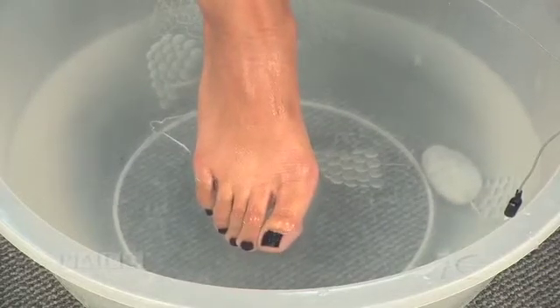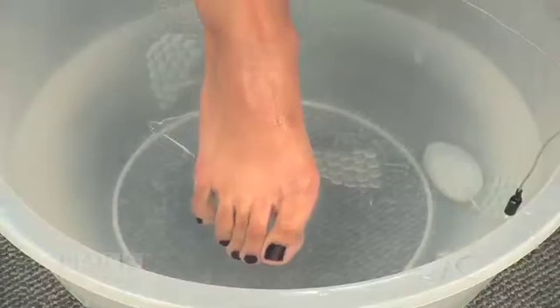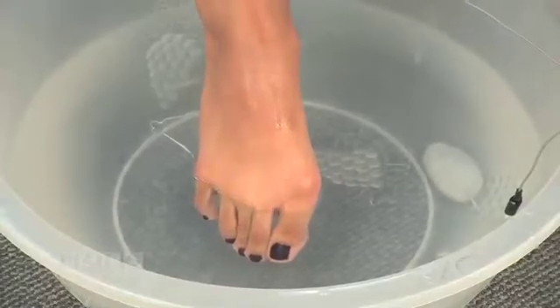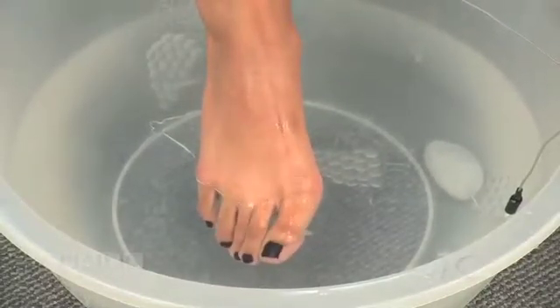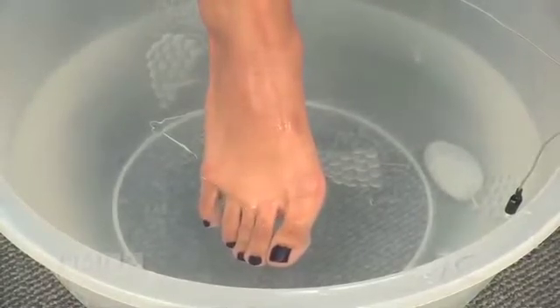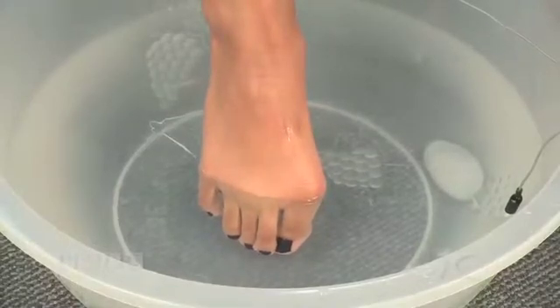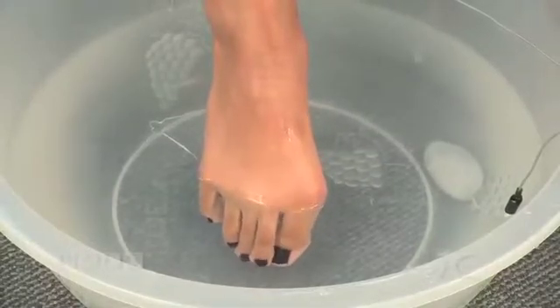Electrical stimulation can also be used with tetanic contractions to manage edema. In this application, the negative electrode is placed into the water along with the subject's foot. The positive electrode is placed distal on the lower leg over the tendons.